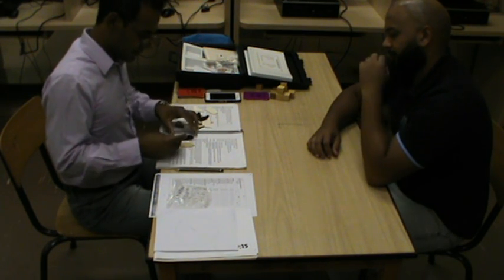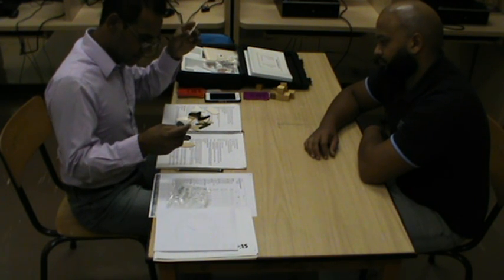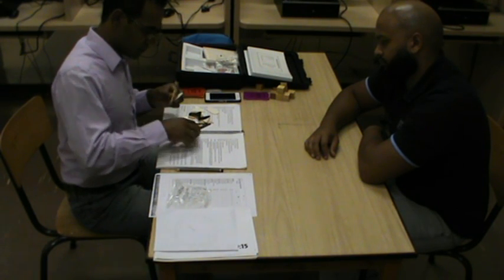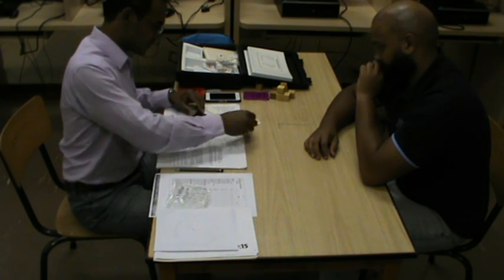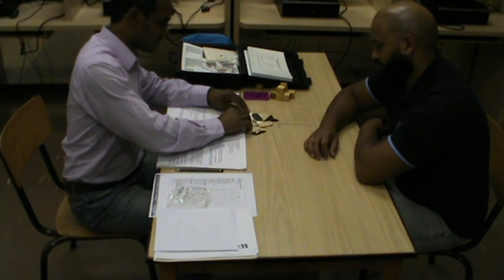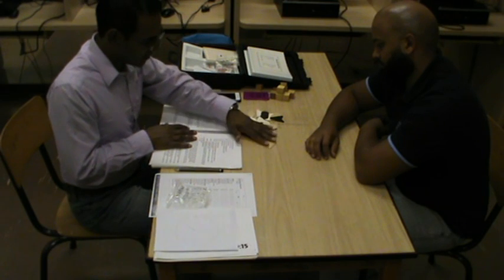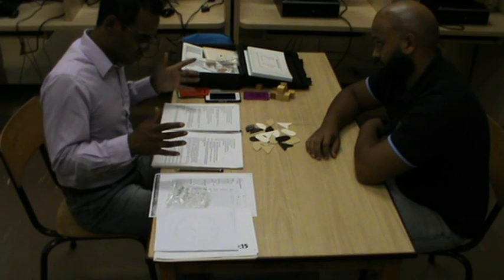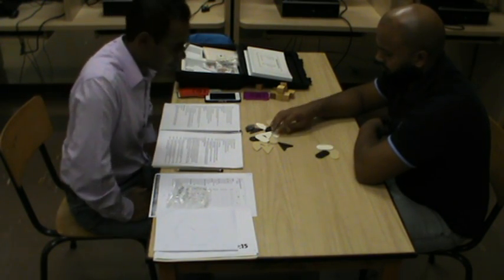Okay, and there are different colors. Cream, you can say, or white, cream, light brown, and then dark brown. So you will ask the client to position these various shapes into what he thinks are similar. Or you can ask, you place this randomly in front of him and ask them, can you position them into groups that are alike or similar, and see what the outcome is.